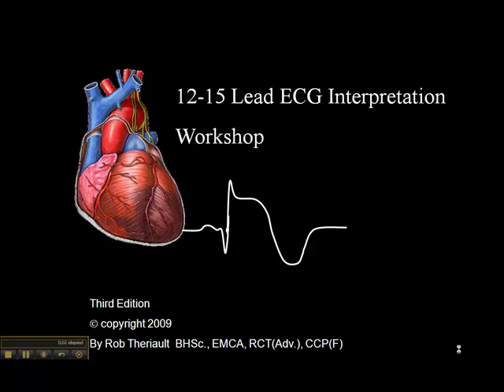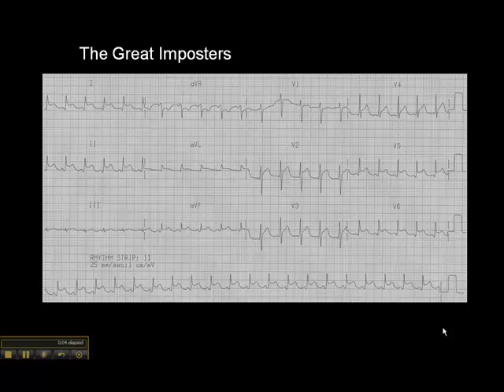This next one is imposter number two, and we'll go through it sequentially again. We see ST elevation in lead two, not in three, but we do see ST elevation in AVF. Nothing in V1, but we have ST elevation in V2, V3, V4, V5, V6, lead one, and very subtle, but in AVL as well.